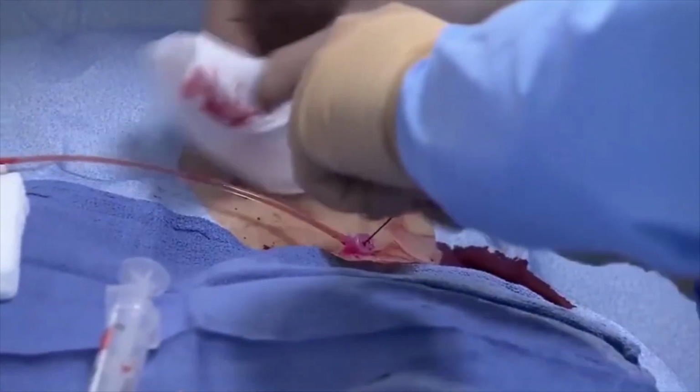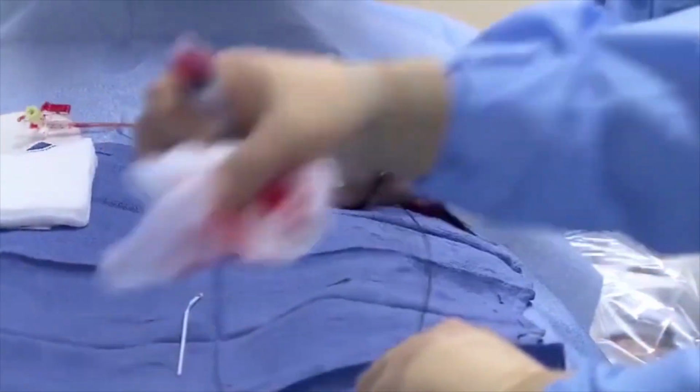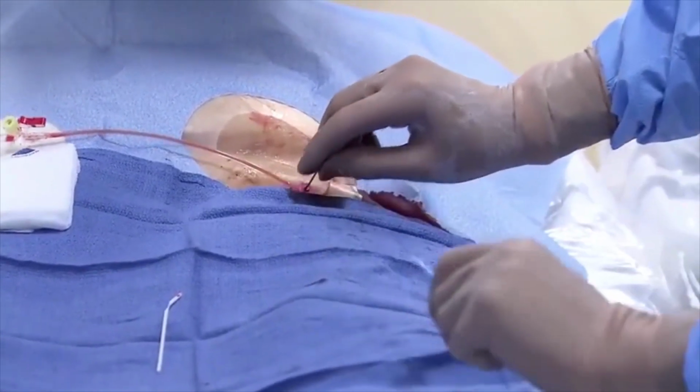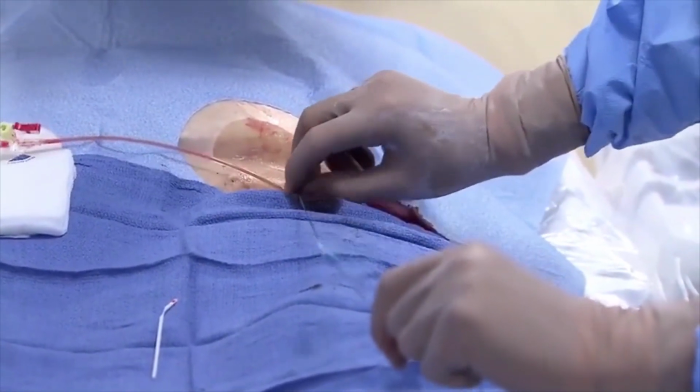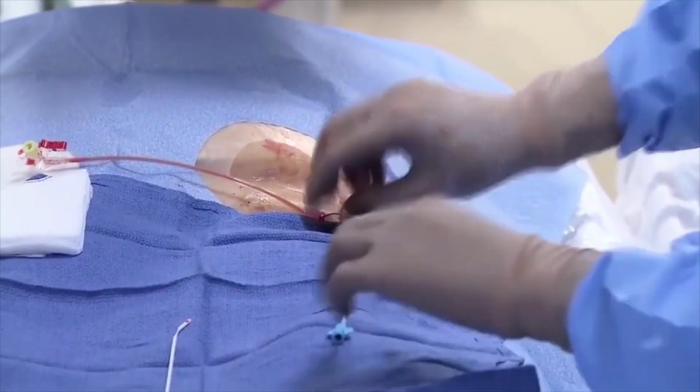And James is loading the diagnostic catheter onto our guide wire. And we're going to manipulate this. This is called a flush catheter, an omni-flush catheter. We're going to move that up into the lowermost part of the main artery in the abdomen, the abdominal aorta.